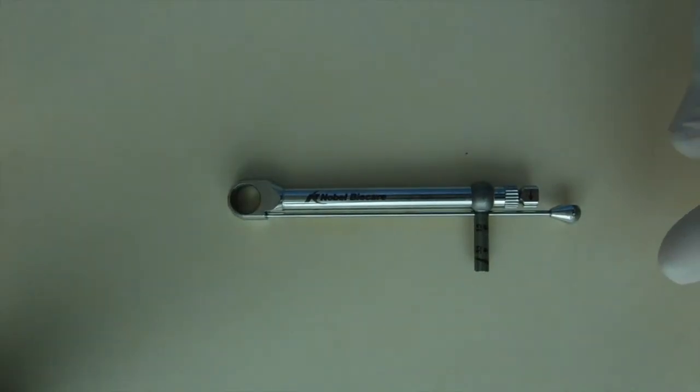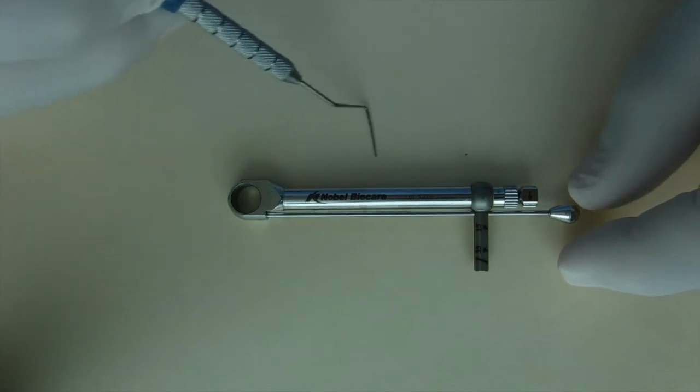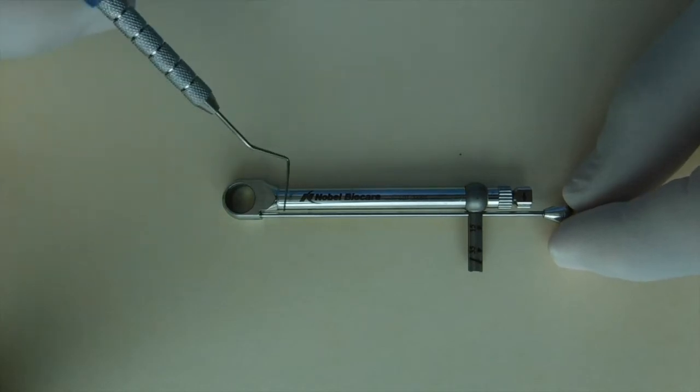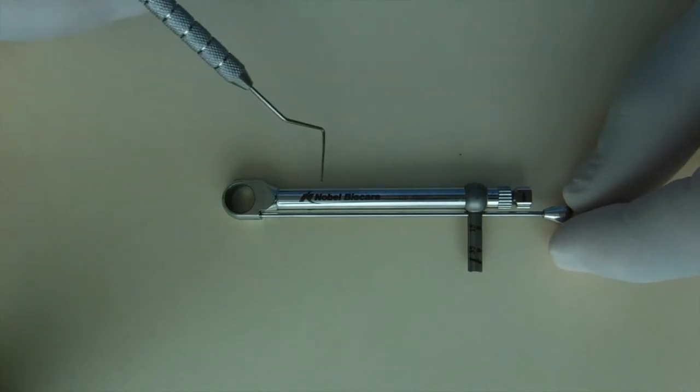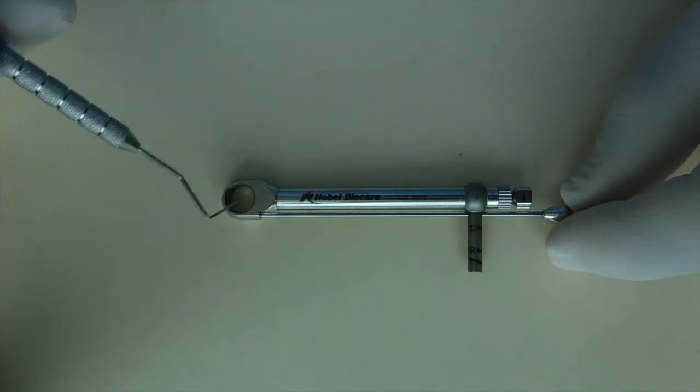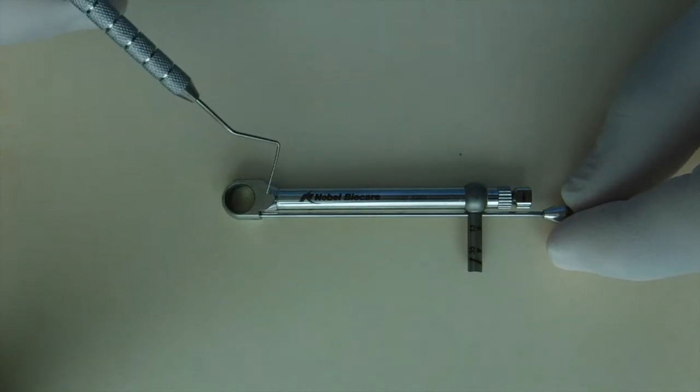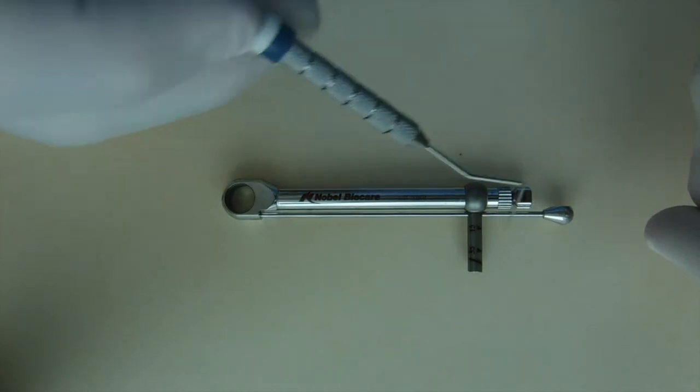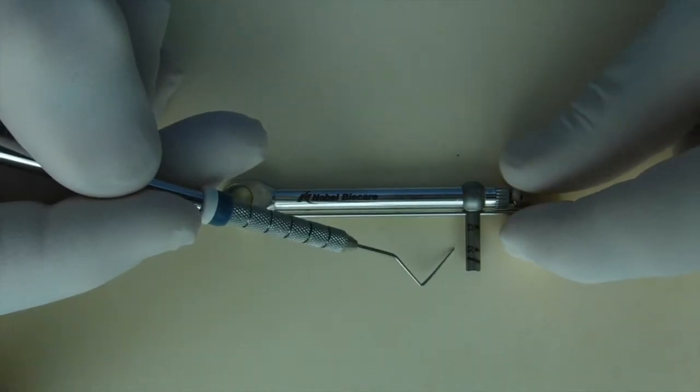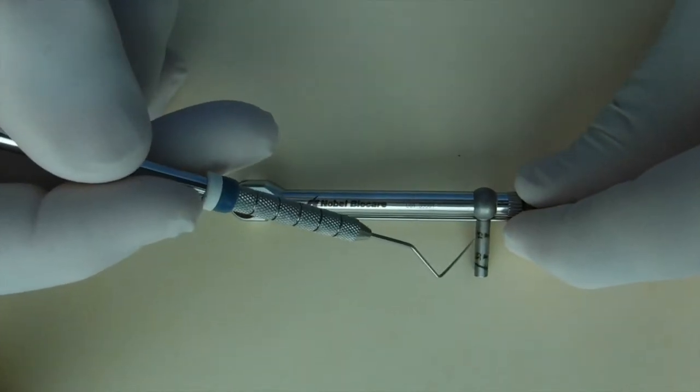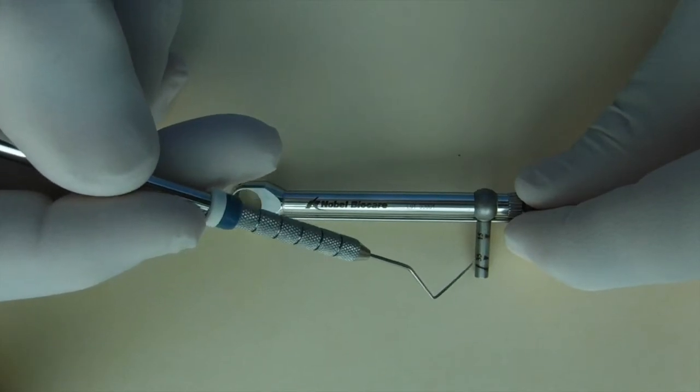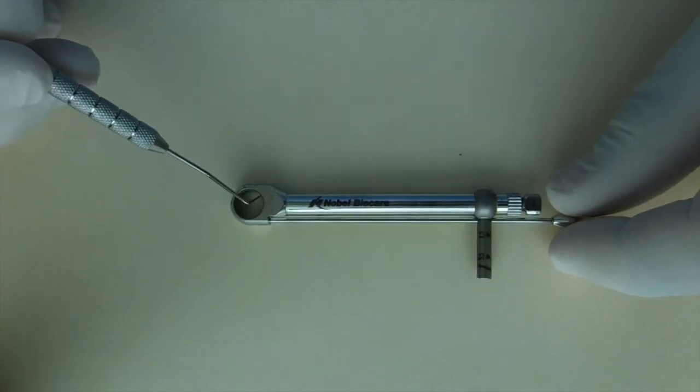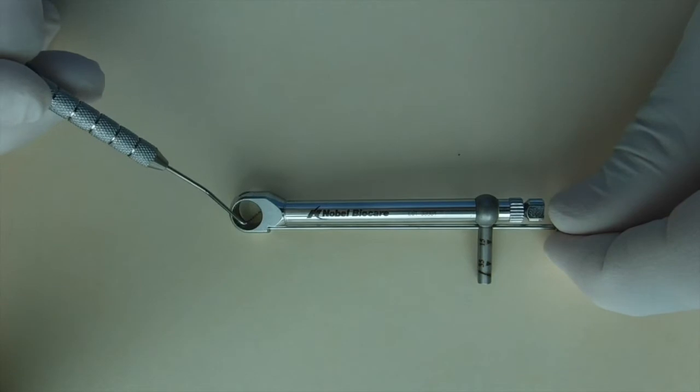The first torque wrench that we'll discuss is most commonly associated with the Nobel BioCare products. It's a double beam torque wrench which has a larger body that houses the components on the inside and a more slender lever arm with a handle. It also has an indicator bar which indicates the 15 and 35 newton centimeters of torque, as well as an opening to accept the driver.